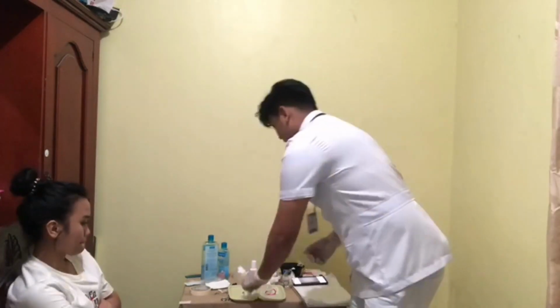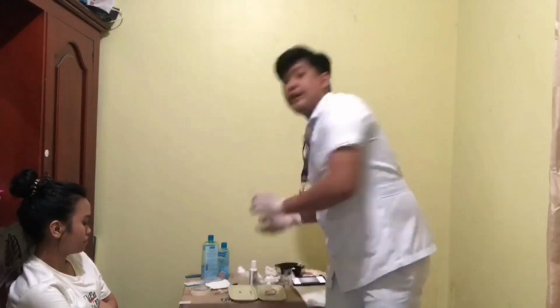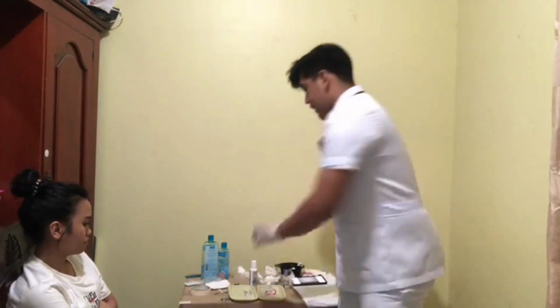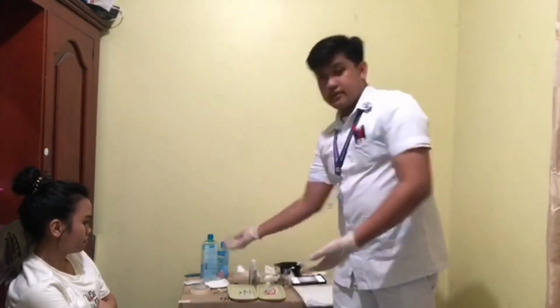The first is the 1 ml, which will be used for the intradermal, then the 5 ml for intramuscular, and the last one is the 3 ml syringe for the subcutaneous site. We also have here the vial and ampule for the medication, and cotton pads and alcohol.